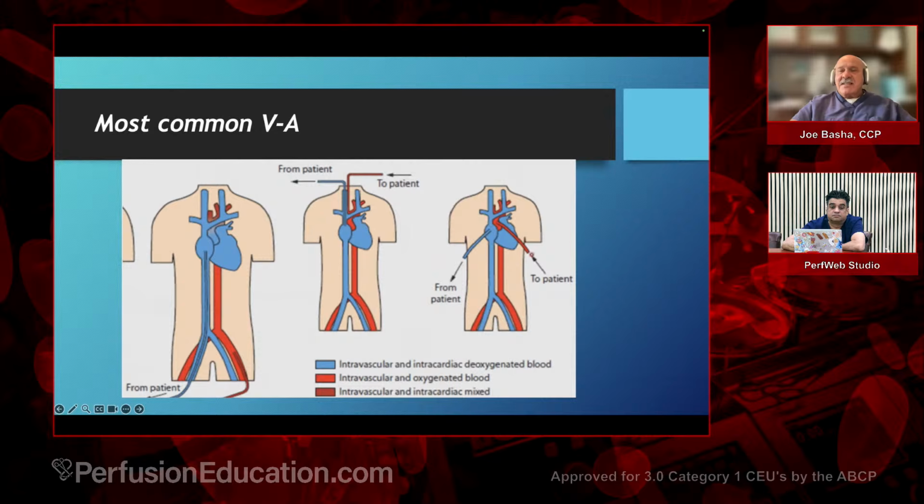And then you have here central cannulation, where you're coming directly out of the right atrium and going back into the ascending aorta. There is a place in Chicago, I don't know exactly which hospital it is, but even in patients that are not post-cardiotomy, let's say ECPR from the ICU, they immediately do a sternotomy and everyone gets centrally cannulated, and this avoids the risk of Harlequin syndrome that does occur with VA ECMO with peripheral cannulation. You always will have Harlequin syndrome.